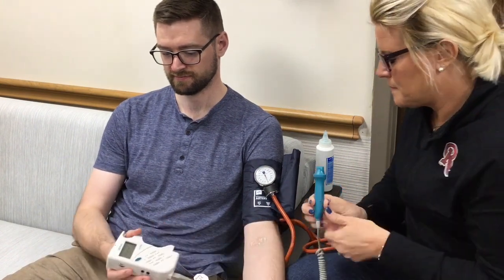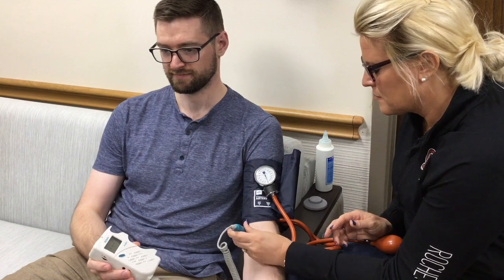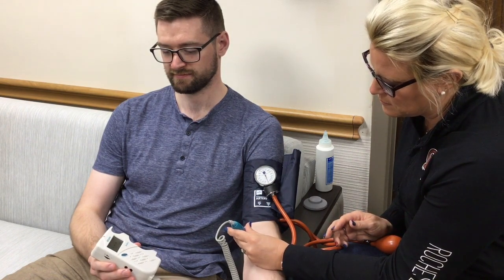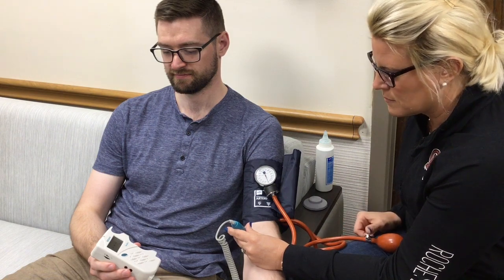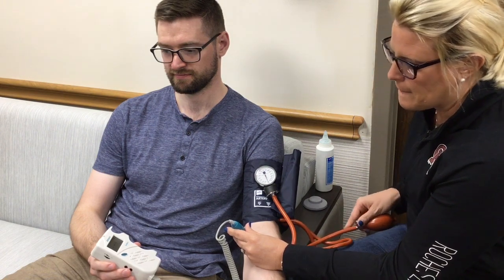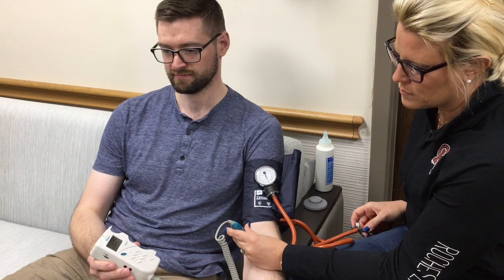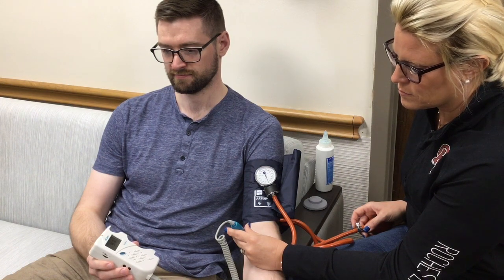Turn the Doppler on and place it on the spot where you put the gel. You can move the wand around slowly back and forth in order to find the pulse. You should hear a repeated swish swish or whooshing sound that is distinct and not caused by the movement of the wand. This can be challenging, so take your time.